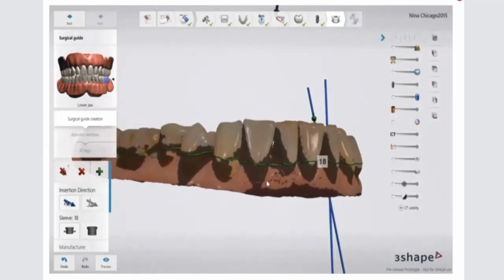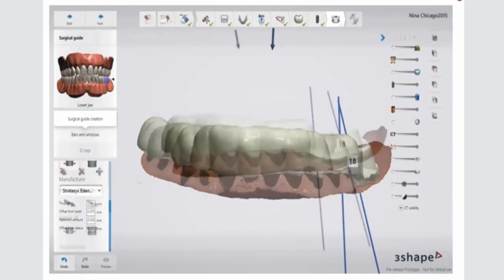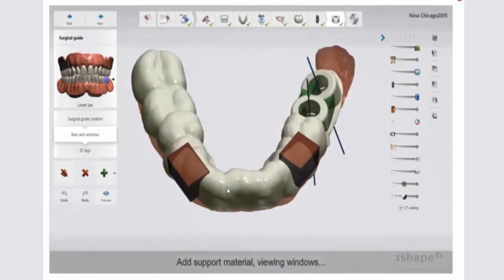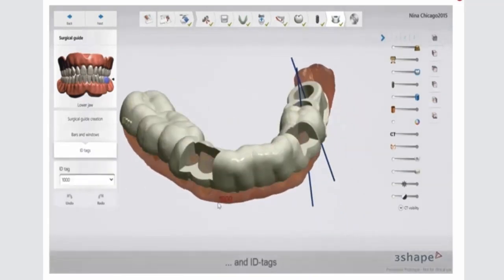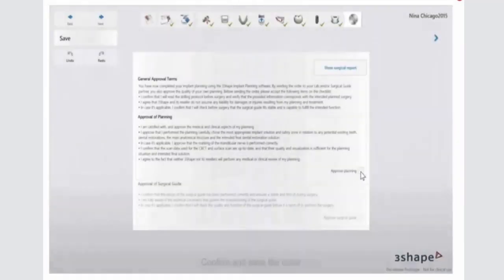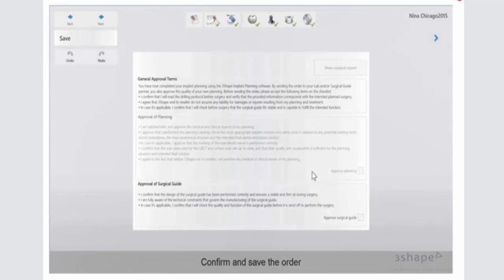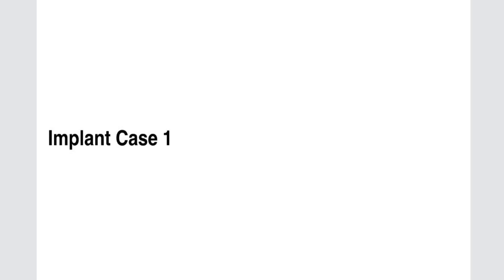One thing that I also want to point out is that when you outline your surgical guide, as you guys are seeing here, you're going to open windows. I suggest that you open as many windows as possible to make sure that the guide sits perfectly on the teeth. If there is any displacement, please be careful, because this can really incur error, and then your implant will be off, and this could be not a good sign for what you are proposing to do. So it is that way that you make the integration.